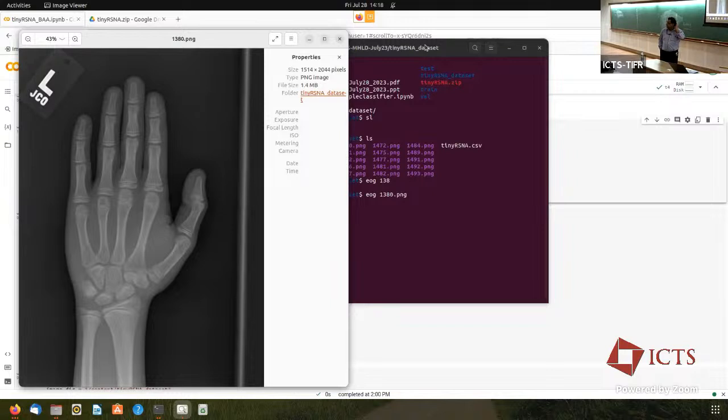So would you do a 2 data set split or a 3 data set split? That's the point. How do you decide?